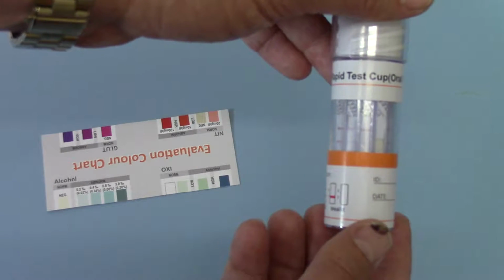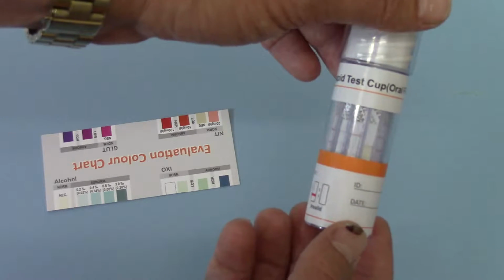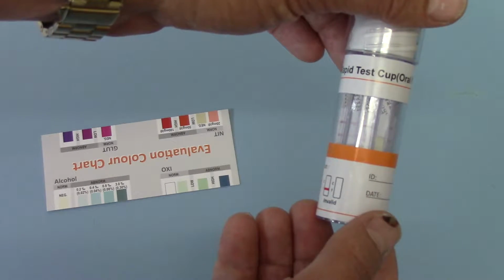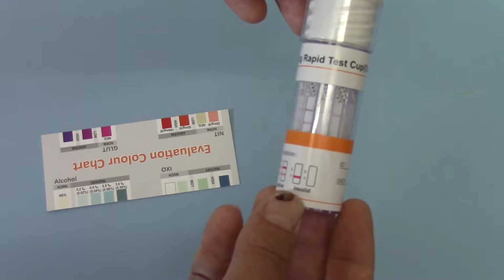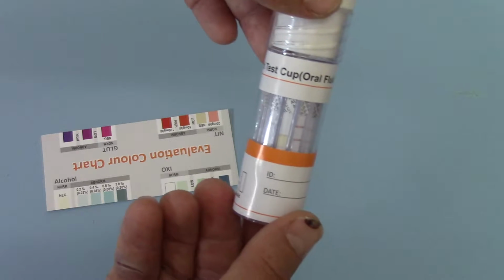That is perfectly normal. It's the presence of any test line discernible at the read time that indicates the presence of a negative result. And that is a negative result, even though it is very faint for PCP. So there you have it, a clear all-round negative test result for 11 drugs plus alcohol.